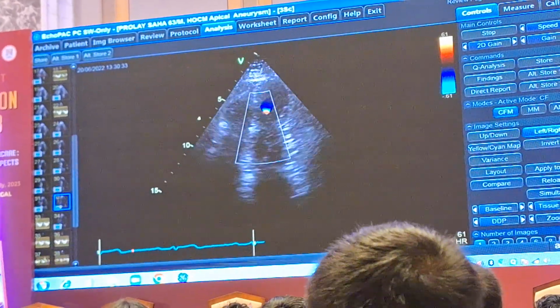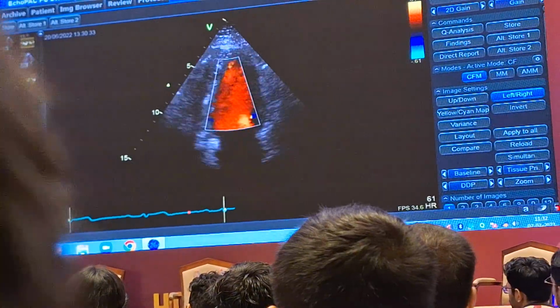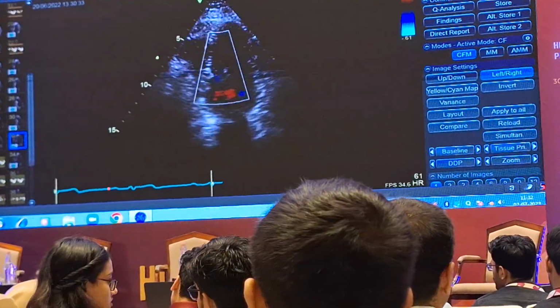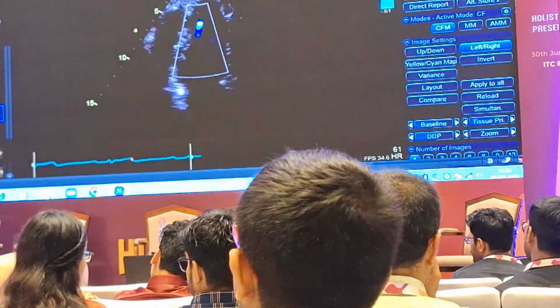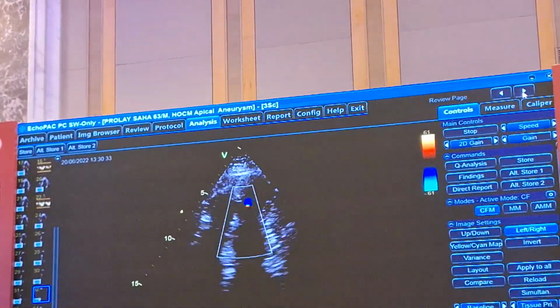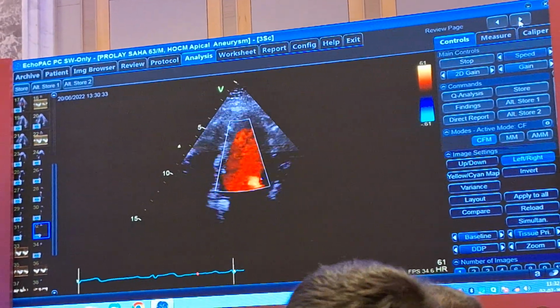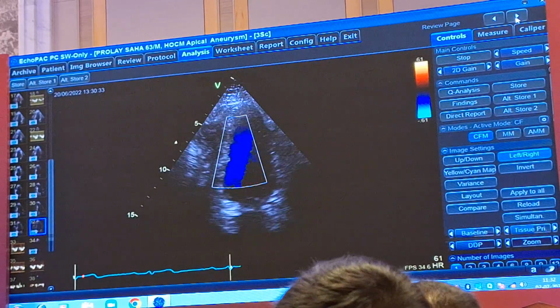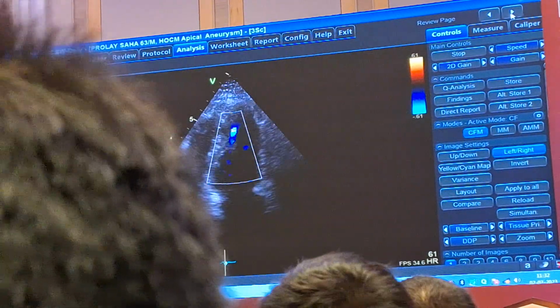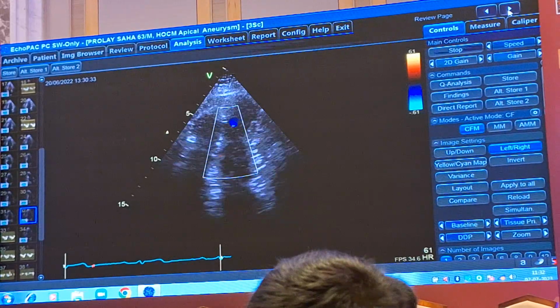There are a lot of things; these are postgraduate topics. Anyway, very difficult to differentiate sometimes, but whatever, now the consensus I'm telling you in a single word: if any part of the left ventricle is more than 15 millimeter, you always look for or exclude hypertrophic cardiomyopathy. So that is a dictum. You may not land in hypertrophic cardiomyopathy because this is basically a genetic disorder.